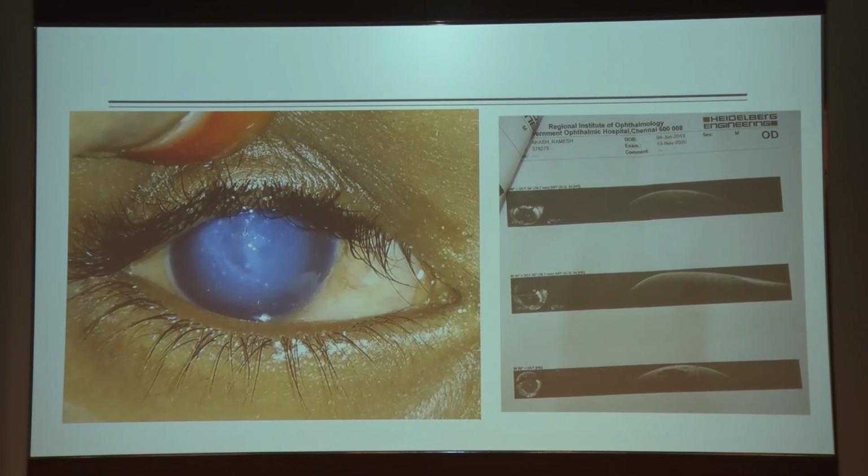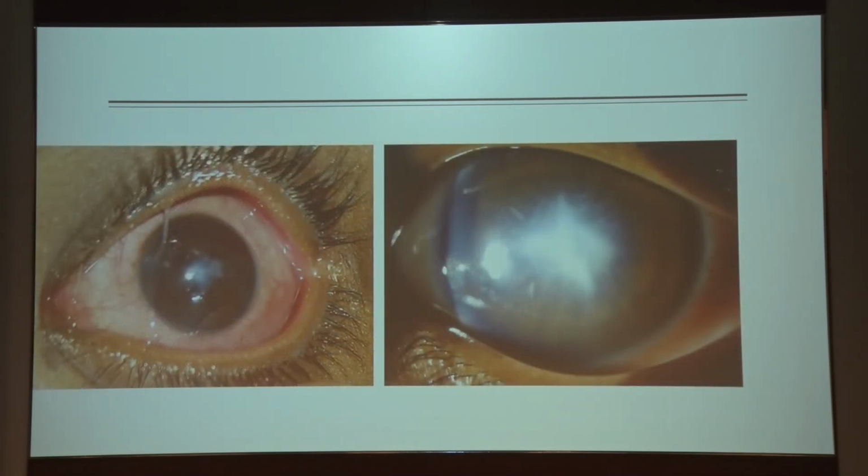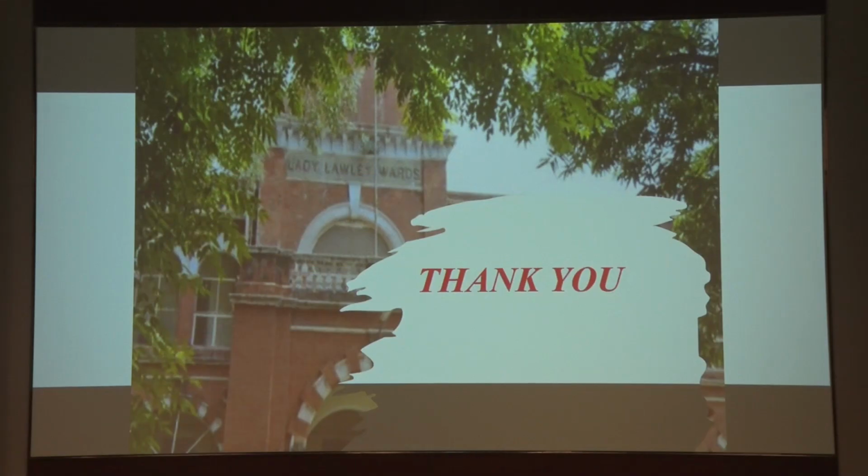You can see the DM tear on the ASOCT and the aqueous seeping into it and causing a hazy cornea. So what was done for this case was pneumodescemetopexy with compression sutures. I think ectatic disorders are covered in a separate session, so I'll wind up with that.